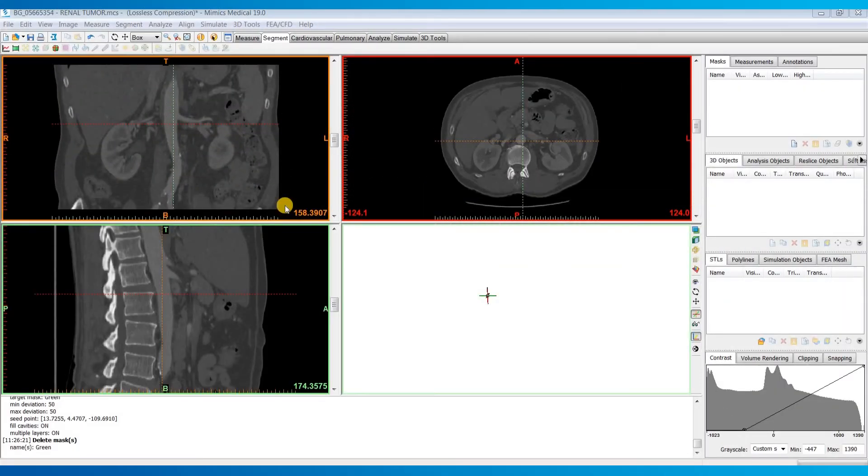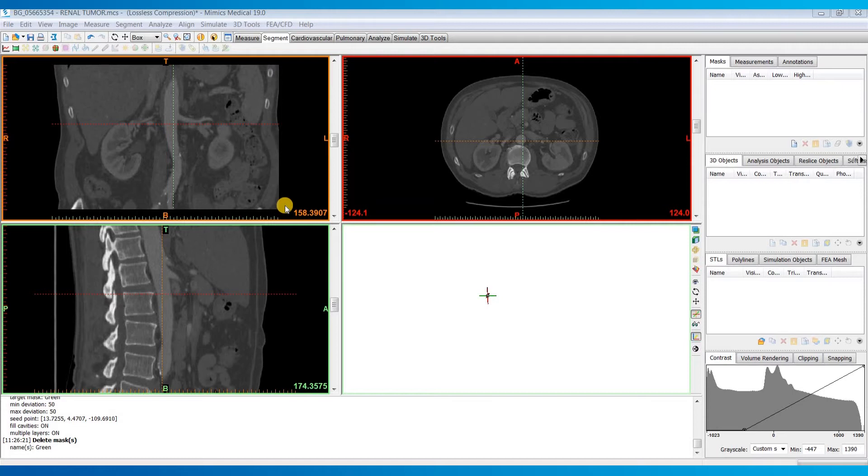Today I will cover the Dynamic Region Growing tool, which is a tool that basically combines thresholding and region growing into one step. It's a tool based on the connectivity of grade values within a specified range of seed points that you can select.